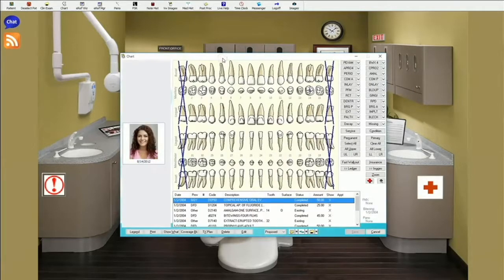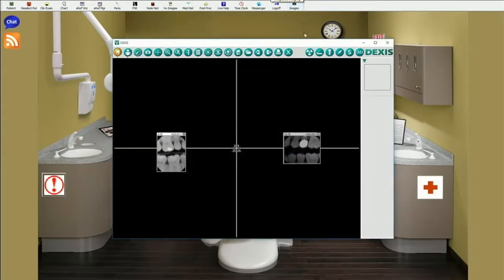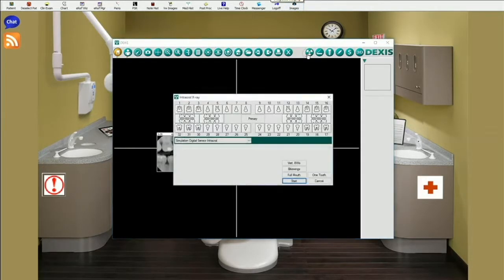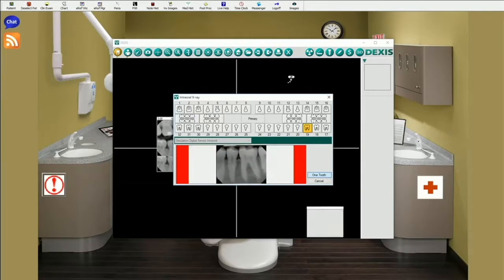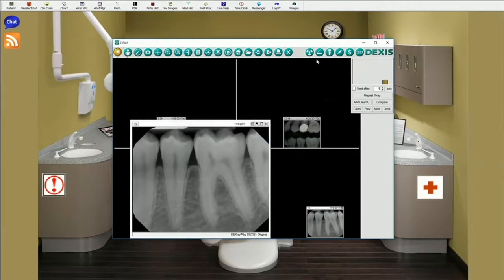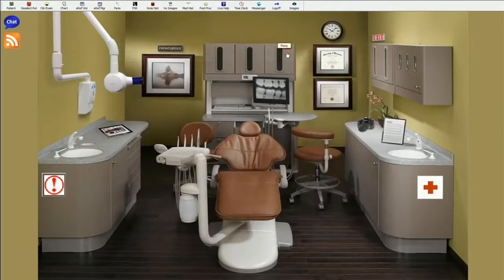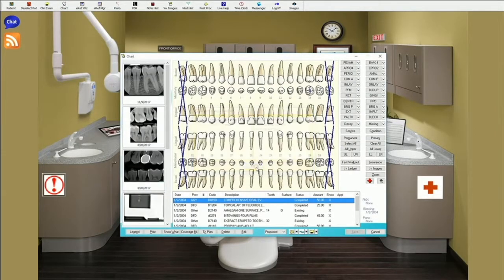In Eaglesoft, simply open a patient chart. Click on the imaging icon and DEXIS is started. Take x-rays and exit DEXIS. The new x-rays are automatically available in the patient chart. You can also double-click any x-ray to enter DEXIS.